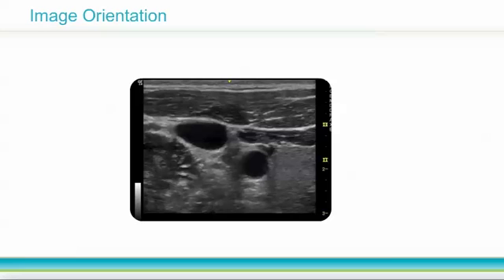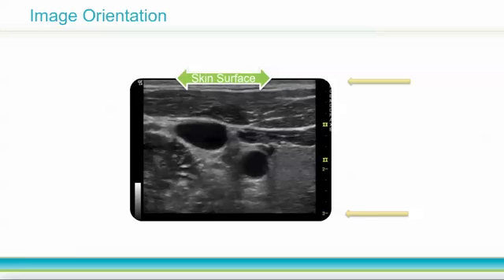One initial challenge in ultrasound image interpretation is understanding the orientation of the image on the screen. The top of the screen represents the most superficial part of the tissue you are scanning, or the skin surface. The bottom of the screen represents the deepest part of the tissue — in this case, 3 cm deep into a patient's neck. The internal jugular vein is seen at 1 cm deep, and the carotid artery at 2 cm.